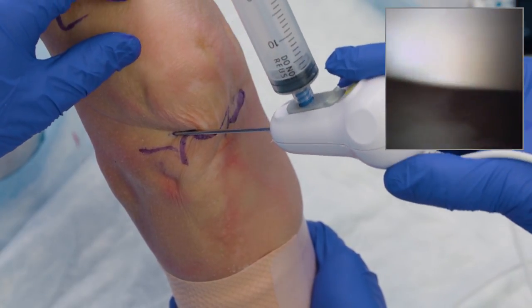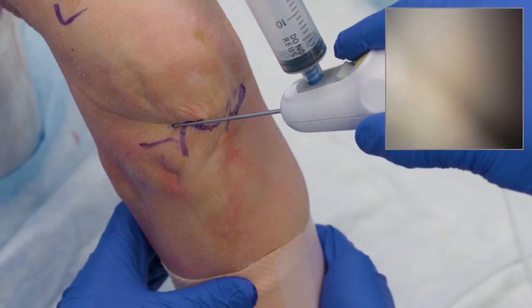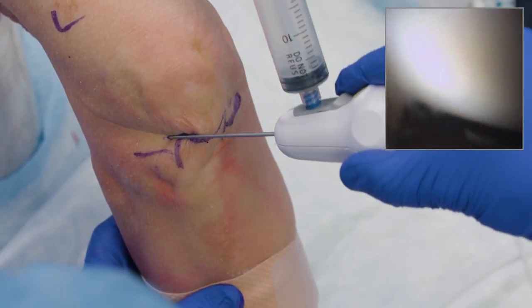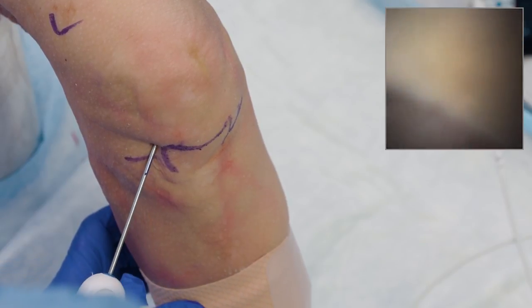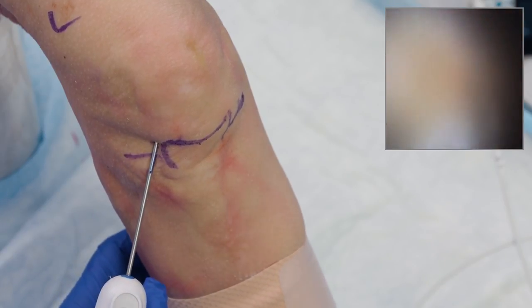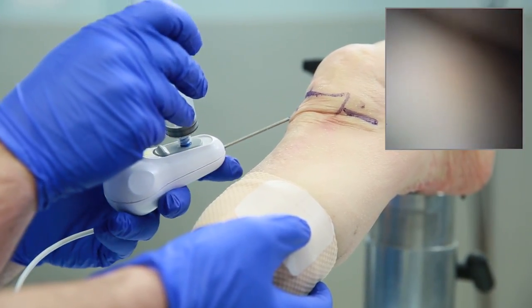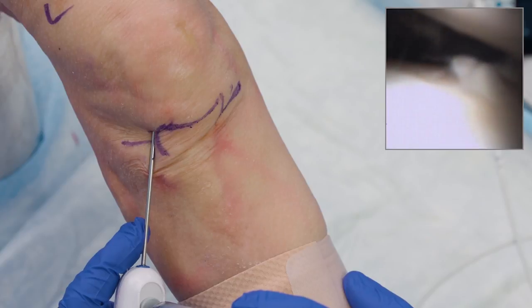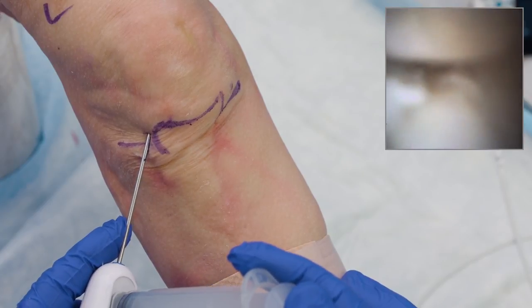I'll drop my hand back down to neutral and get into the lateral gutter by retracting back a little. There's some synovium in the lateral gutter, but it allows me to get up and view it. If I drop my hand and swing up toward the patella, I can get into the patellofemoral joint area. Being careful not to over-inflate the fat pad keeps it out of the way. I extend my leg while dropping my hand toward the floor, allowing me to view my trochlea as well as my patella. There's my patella in the superior portion of the picture, and swinging down reveals a little cartilage change on the trochlea.